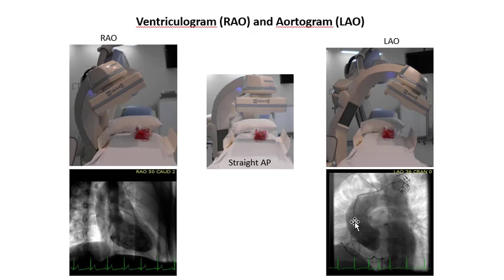This is an aortogram, so the dye that's injected into the patient to visualize these soft structures is used to show the cavity of chambers, such as the heart, such as the ventricle, the atria, in this case, the aorta. In this case, the ventricle, which also lights up the aorta.